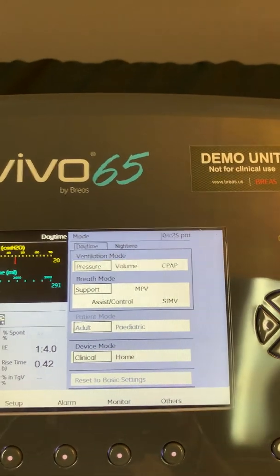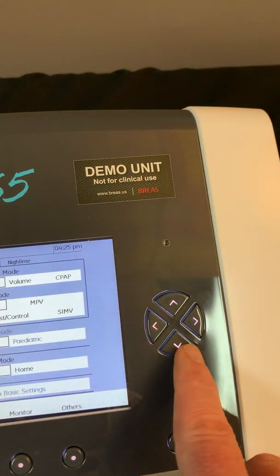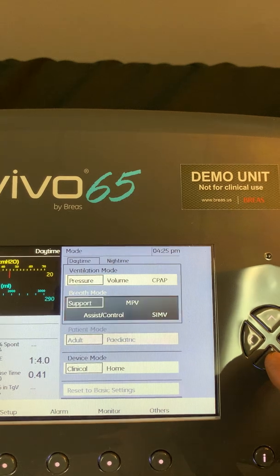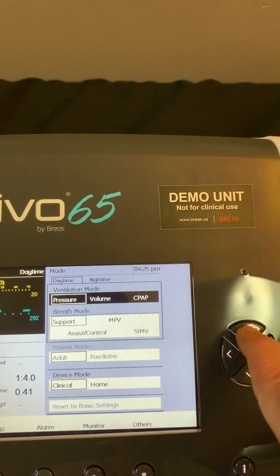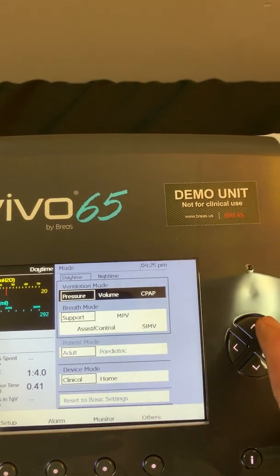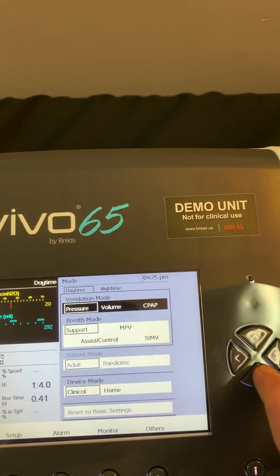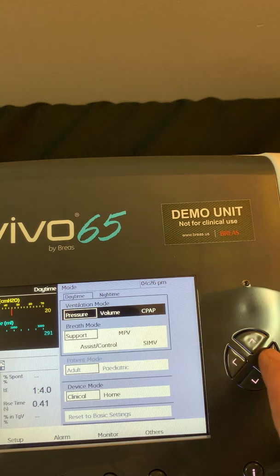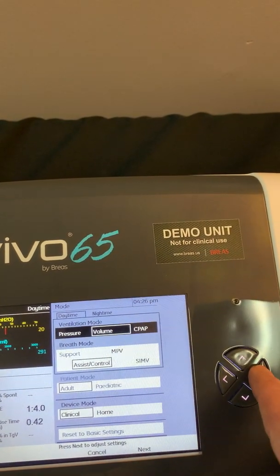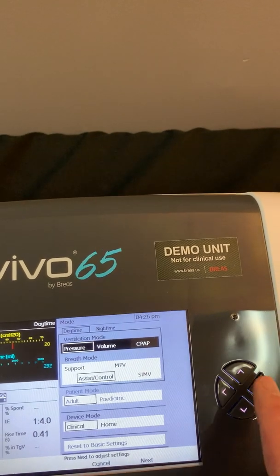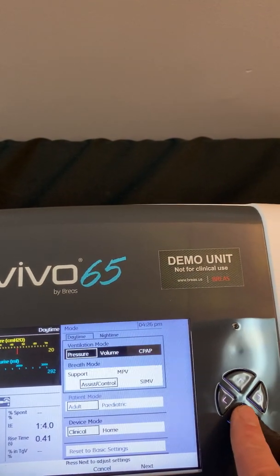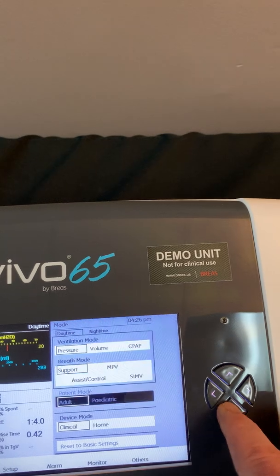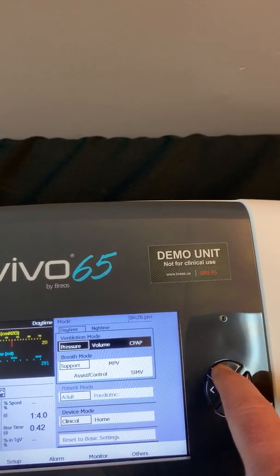In order to make a change within my mode menu, I use the four navigation buttons. I can navigate through my menu by either moving down from the top or I can move up from the bottom. I'm going to highlight the parameter that I want to change by moving up or down, and then I'm going to move left and right to make a change. So just remember: up and down always highlights something, and left and right will always change something.